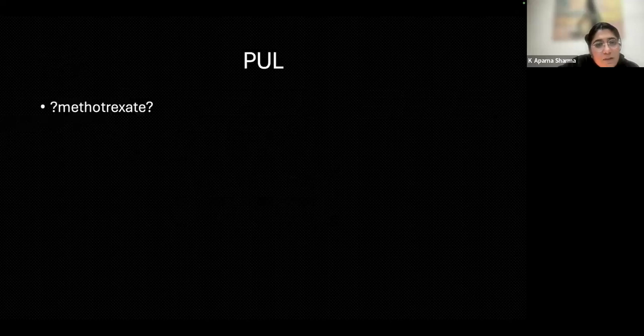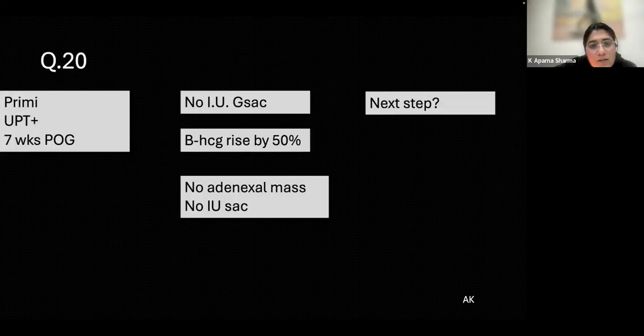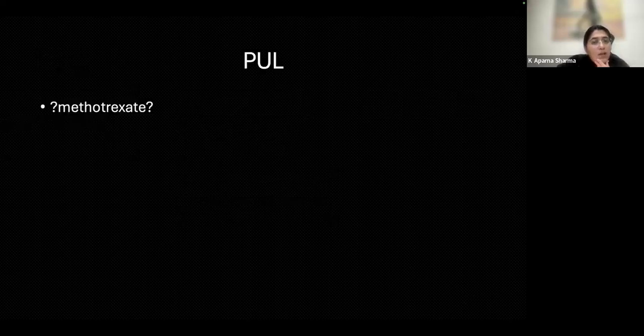Yeah. So I think that's absolutely correct, sir. What you're saying is, okay, let's not just jump the gun. We have to wait. We want the beta HCG to rise by 66%, but it has risen, just not to 66%, and it has not fallen. So we are in the middle, but you still can't see an adnexal mass, no intrauterine GSAC. So possibly we are looking at a pregnancy of unknown location.